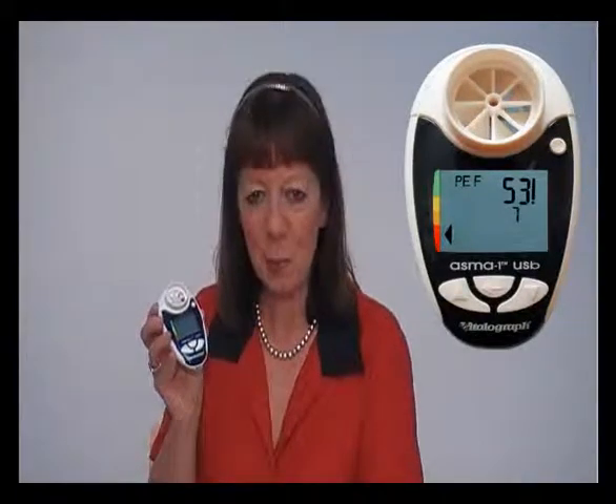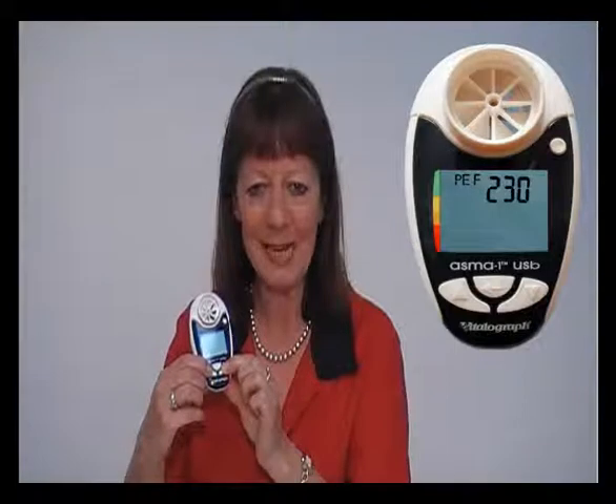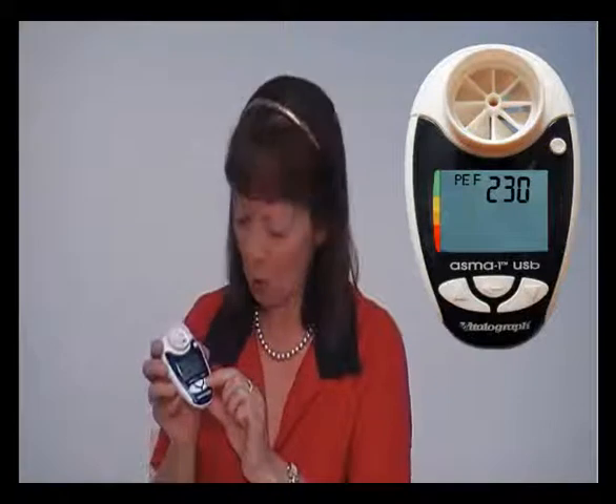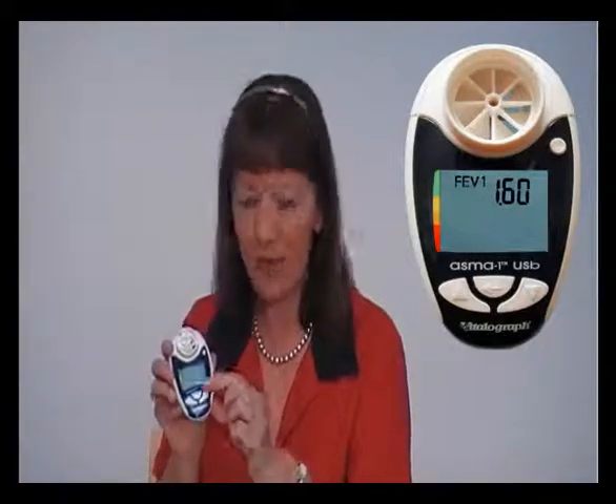With the Vitellagraph AsthmaOne, you also have the facility to enter your own personal best measurement for peak flow and FEV1. In order to do this, simply switch the device on and hold the up and down arrows together for three seconds. Use the up arrow to scroll up to your personal best peak expiratory flow and then press the enter button. If you wish to enter your personal best FEV1, this is done in the same way by pressing the up arrow to reach the value and then the enter button.